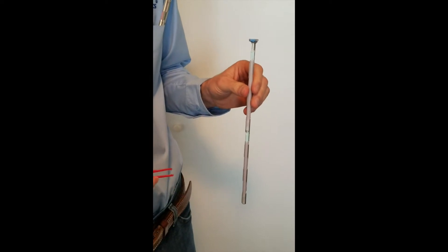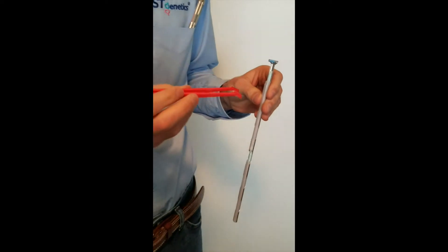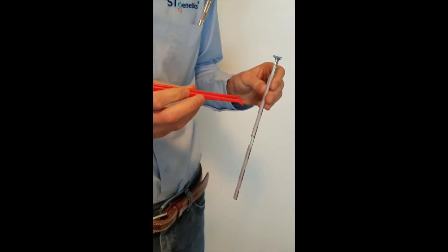Here we have sexed male semen — you can see it comes in a blue straw. The rack also has a blue tab on top to easily identify it before you pull it out of the tank.